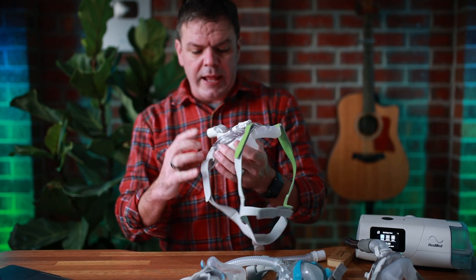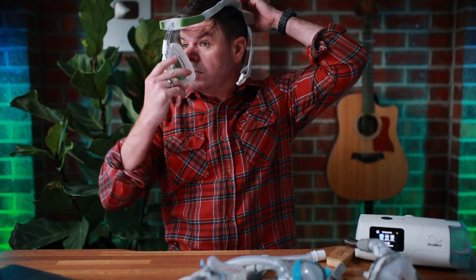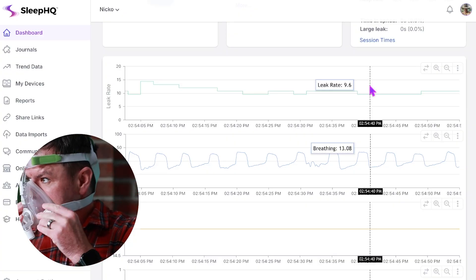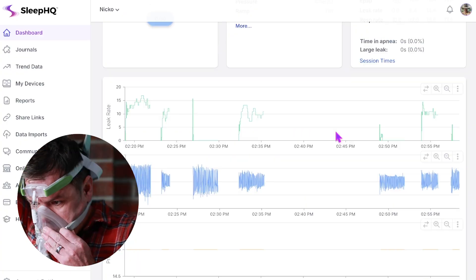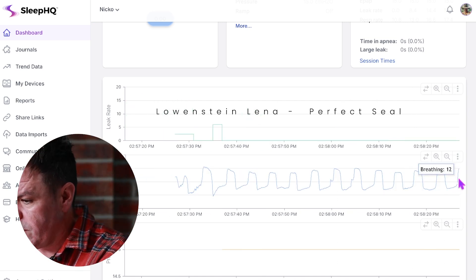I'll grab one more mask — the Loewenstein Lina. And just as expected, perfect seal.